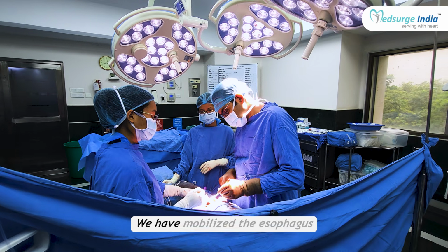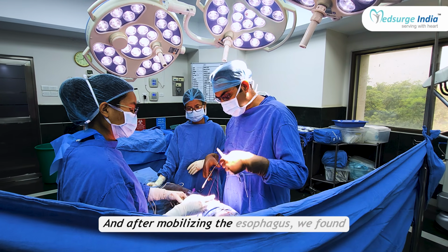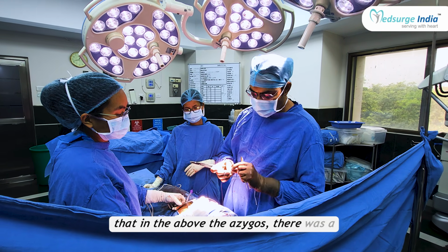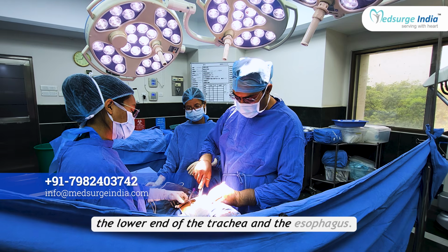We have mobilized the esophagus, and after mobilizing it, we found that above, there was a tracheoesophageal fistula between the lower end of the trachea and the esophagus.